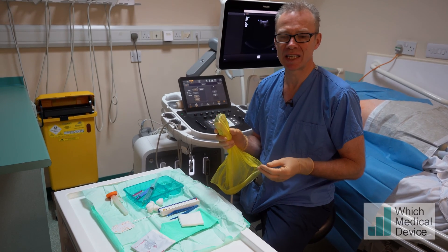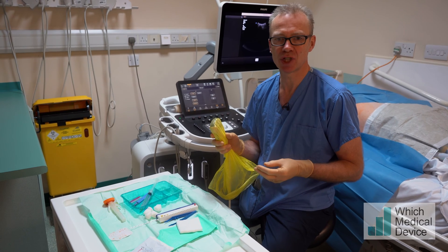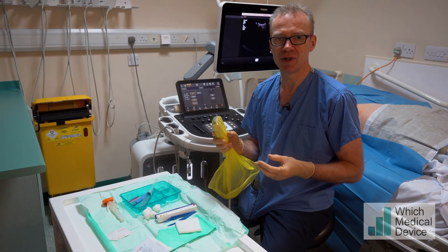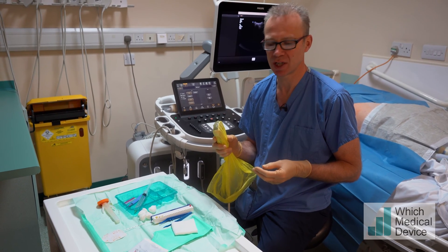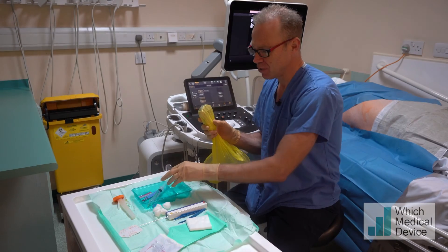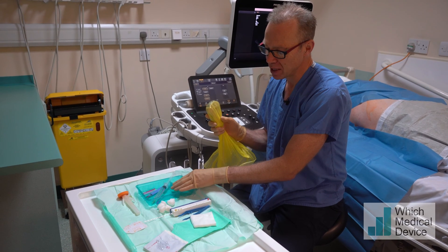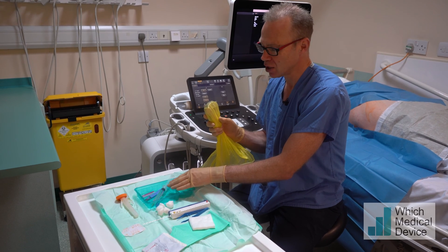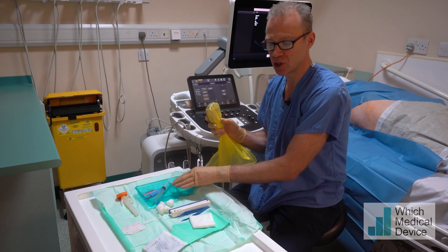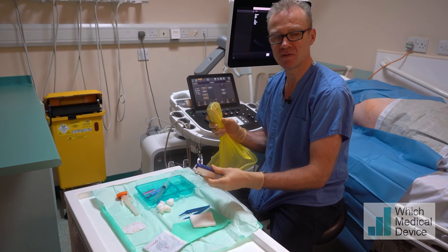This gentleman is here for an ultrasound-guided liver biopsy. He has fibrotic liver disease which has been followed up for a year or so on ultrasound, and now we're going to do an ultrasound-guided biopsy to assess the degree of fibrosis histologically. We've mixed 1% lidocaine with 8.4% bicarbonate — 1ml — which neutralizes the acidity within the local anesthetic and makes it less painful to inject. We've got an 18 gauge BioPince biopsy needle which gives us very good cores.